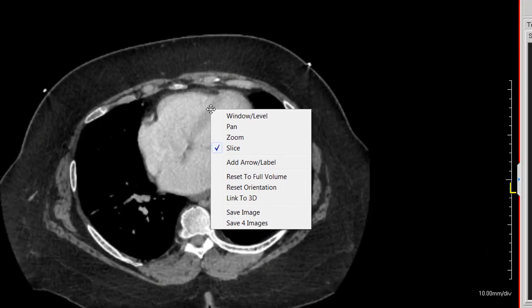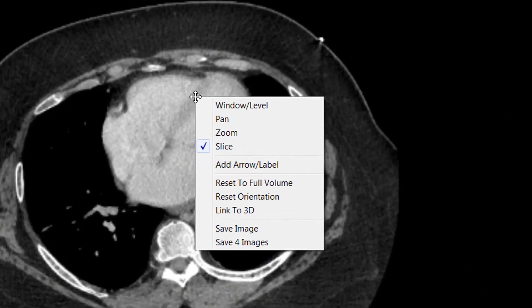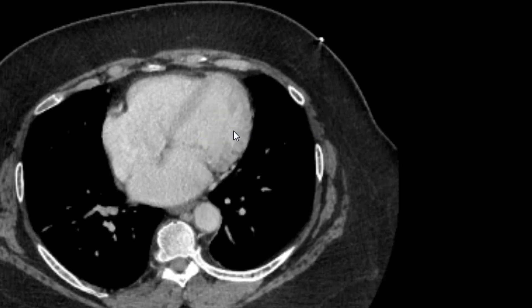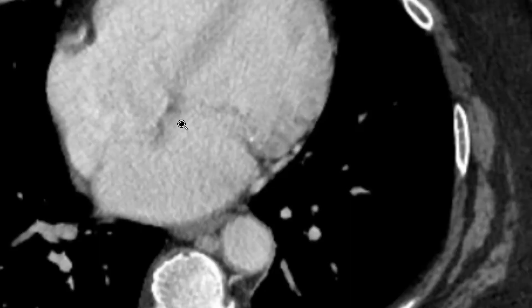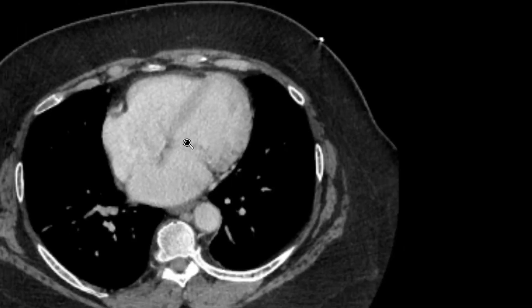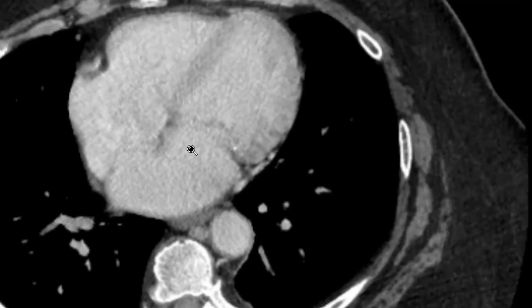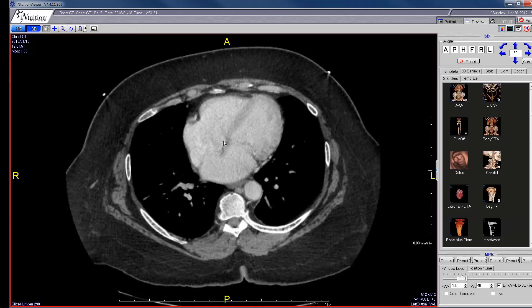If you right-click, you get several different options: window level, pan, zoom, and slice. Slice is the scrolling we just demonstrated. Clicking zoom will allow you to zoom in on the image and zoom back out using the left mouse button.